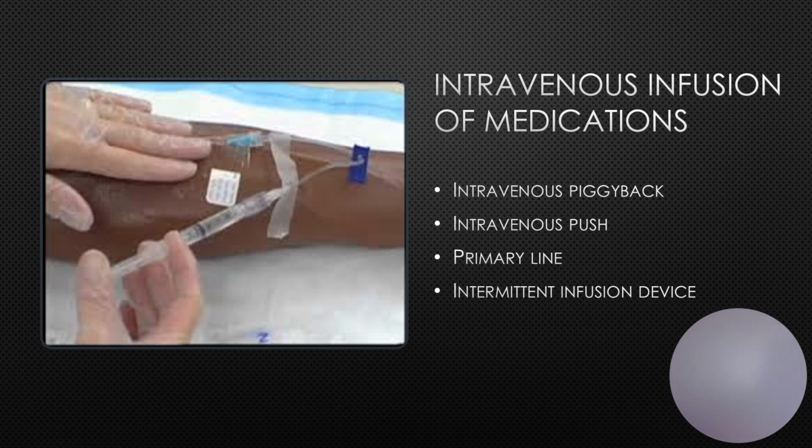When you go in to administer the medication, you're going to do your 6 rights. Always identify your client with your 2 methods and check for allergies. And be familiar with the medication itself. What types of risks might be encountered with this medication? Is it a vesicant or does it have irritant properties? Explain the procedure to your client, assess the vascular access device system and function, and assess the medication container for leaks, contamination, and/or expiration.